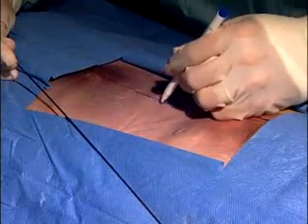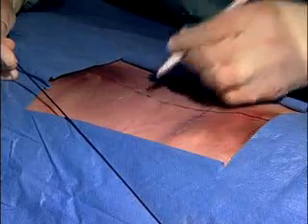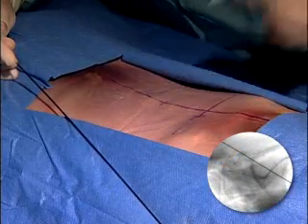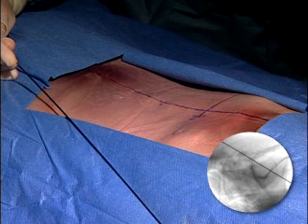One technique to help see the proper trajectory is to place a K-wire near or on the patient while the lateral fluoroscopy images are being taken. Adjusting the position of the wire will determine the best trajectory. This information is used to determine the entry point on the patient's skin and start point on the facet.